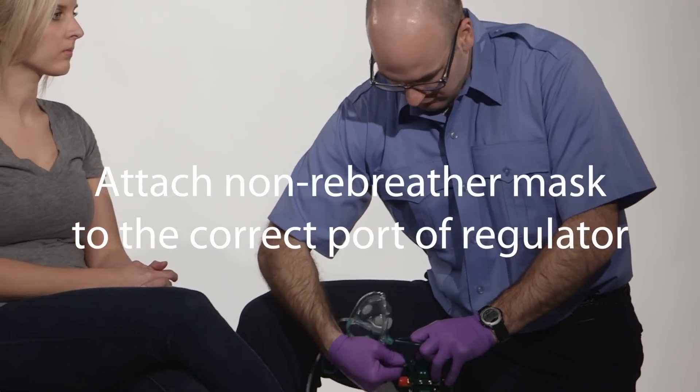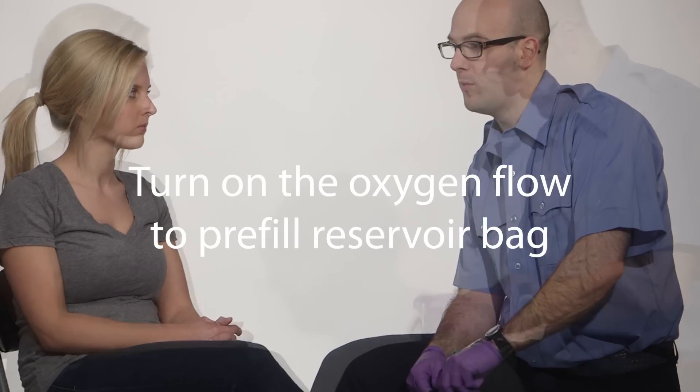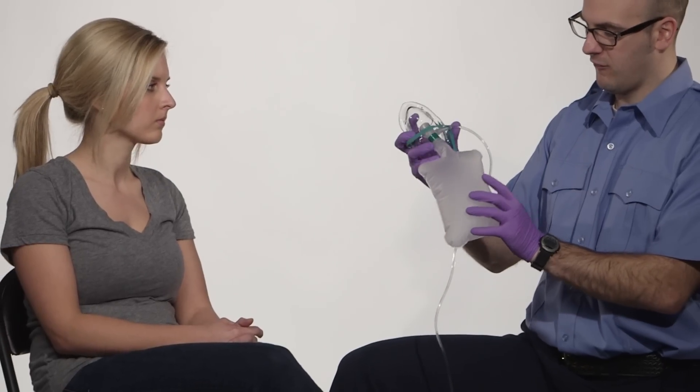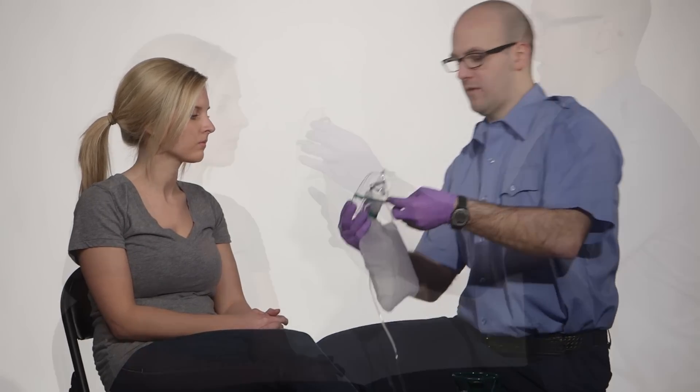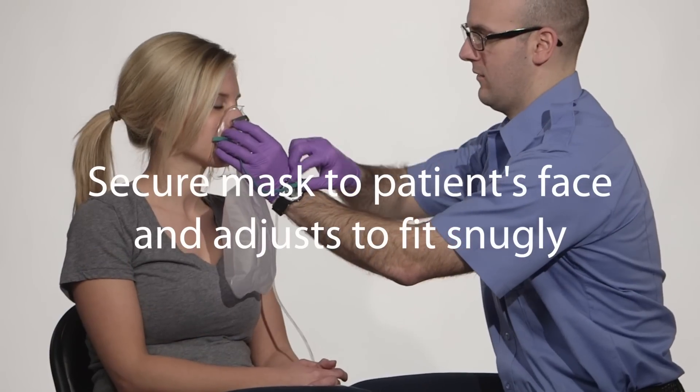You must attach a non-rebreather mask to the correct port of the regulator. Turn on the oxygen flow to pre-fill the reservoir bag. Adjust the regulator to assure oxygen flow rate of at least 10 liters per minute and secure the mask snugly to the patient's face.